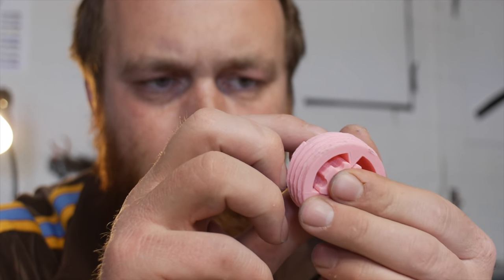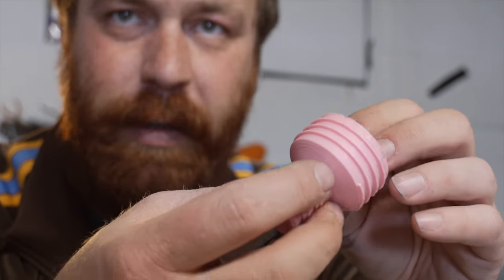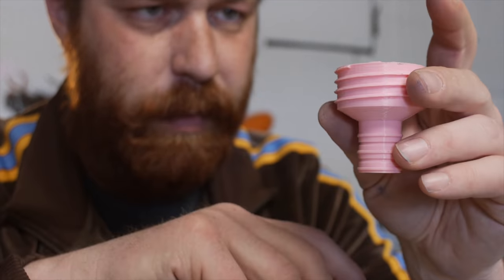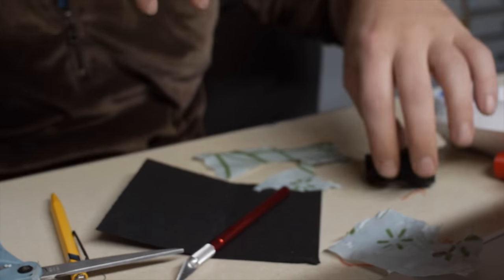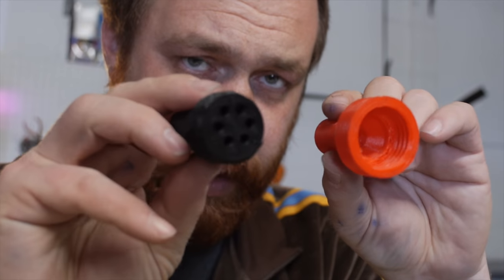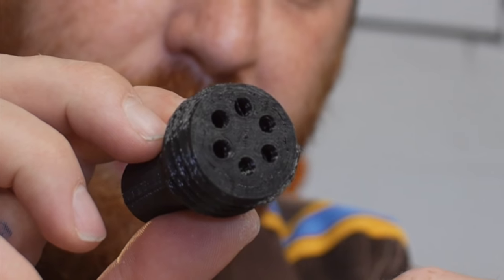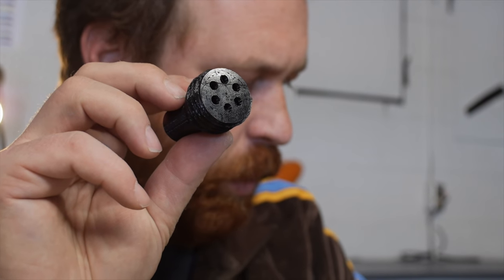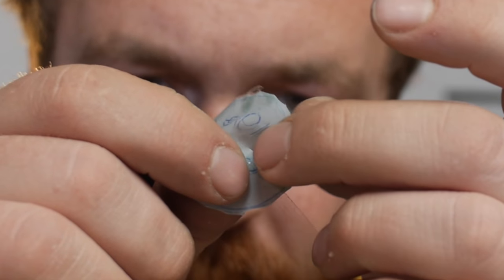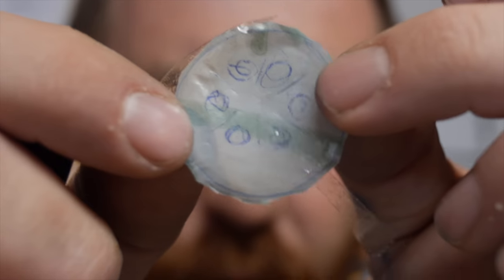Maybe we could sand it to that point, but we need something that comes out quick and doesn't require hand artisanal valves. It just needs to work. Geometrically, at least in the model, that would work, but that's no good. So we've been using your design for these two halves screwed together, with these six holes here, and your original design was to put slits between the holes, so when you blow, the bag can puff up just a little bit. But that didn't work super well.